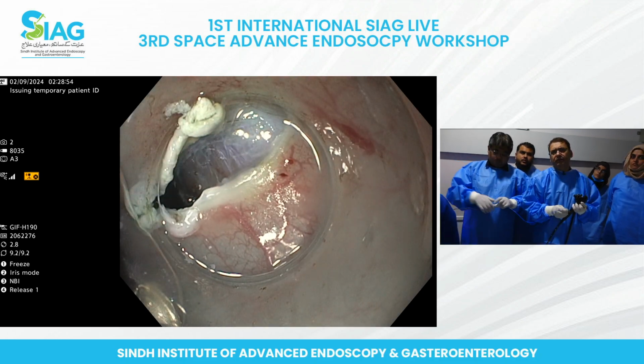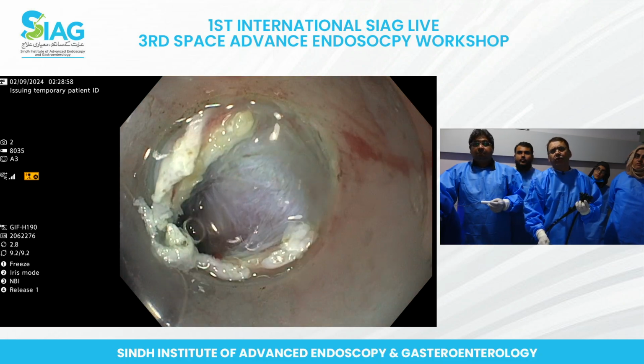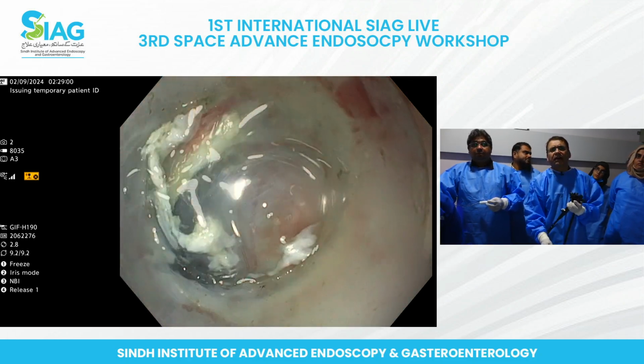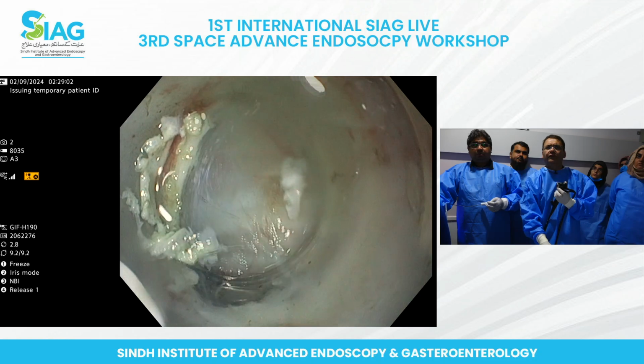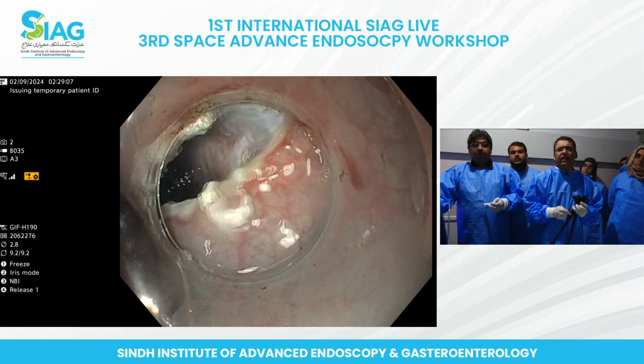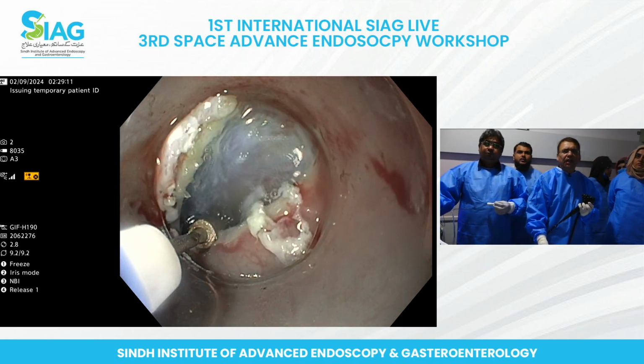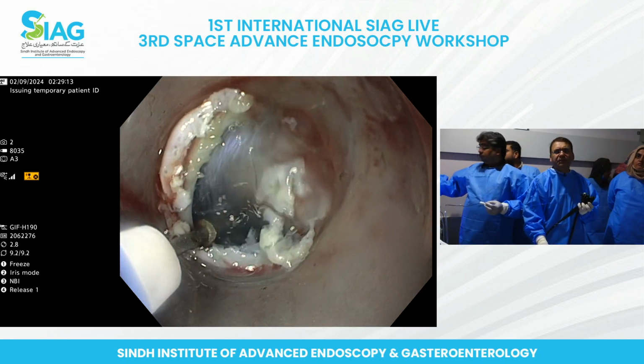Pull the knife back a little. Okay, good. I will see if I can get in with this. If not, then I can always create more space and cut downward. So I think what I'll do is I will cut a little bit more, knife off. I will cut a little bit downward here, and that should be enough for us.